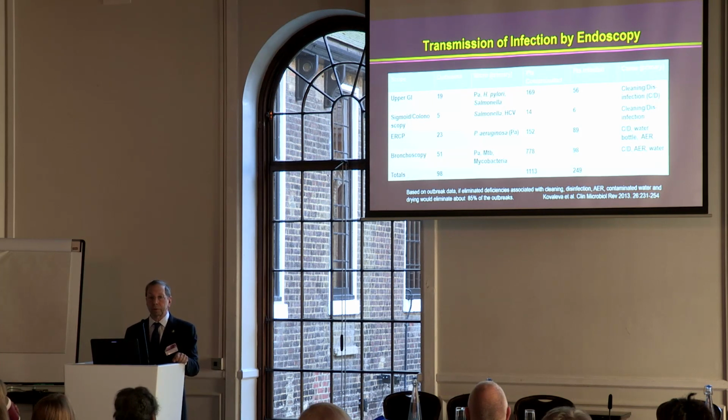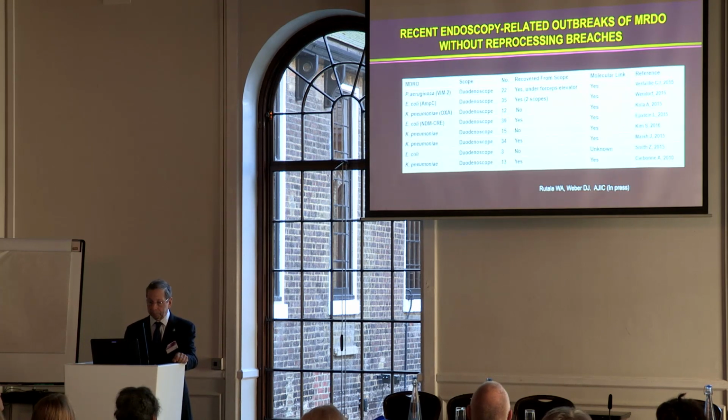There could be 100 or more steps in proper cleaning and disinfection. So it's easy to make mistakes. More recently, and again in a different article in press in the same special issue, Dr. Rutala and I looked at some of the endoscope-related outbreaks now of multi-drug-resistant organisms. The importance here I want to point out to you: these are without reprocessing breaches.